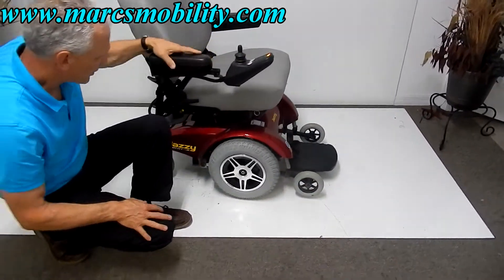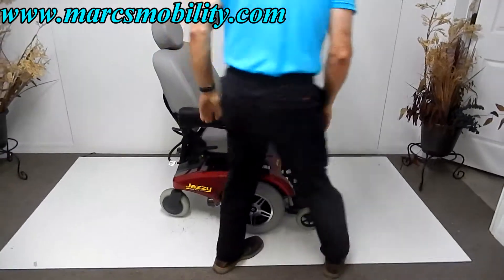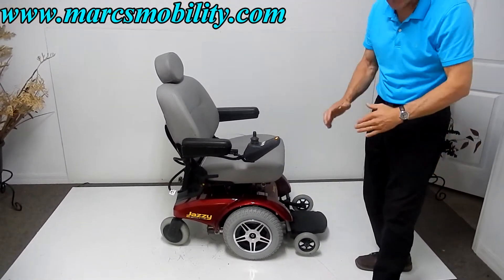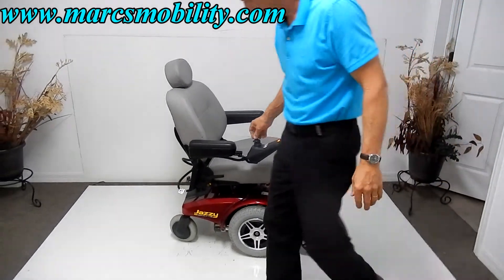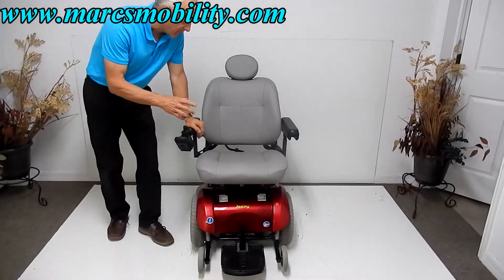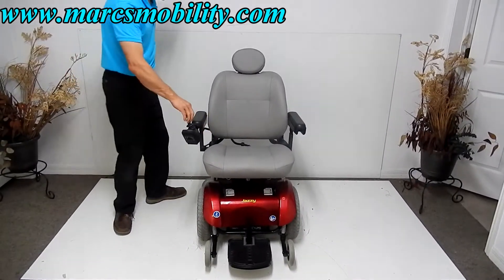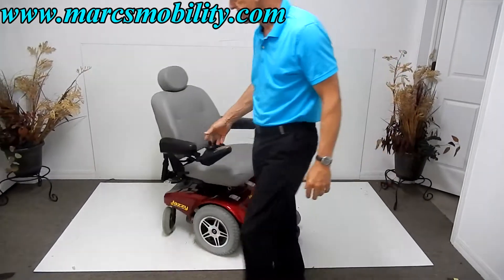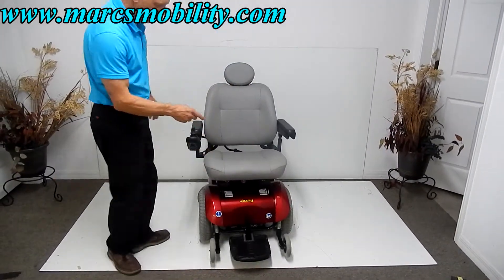Great suspension on this chair. You've got anti-tip wheels in front — these wheels will move up and down depending on what you go over. If you go over an obstacle, they'll raise up. So if you're looking for a power chair with a 400-pound weight capability and a really good turning radius, with a nice 21-inch by 19-inch seat, I would definitely look at this one.